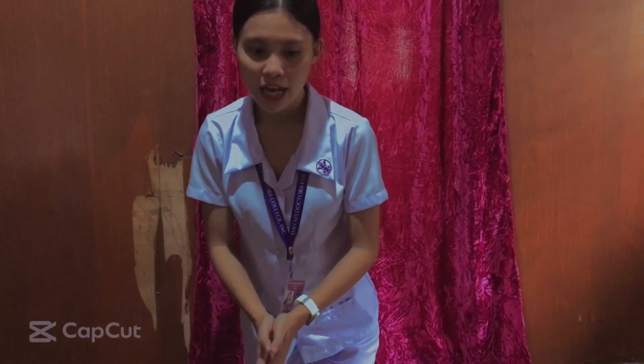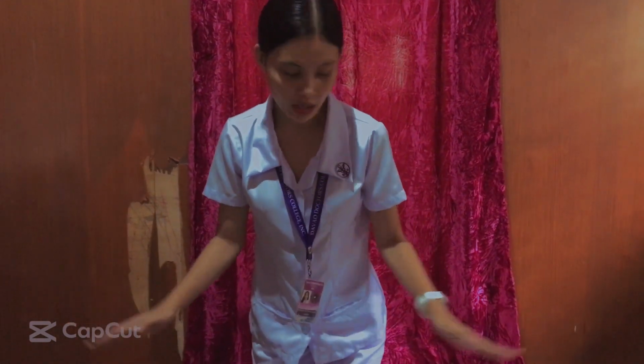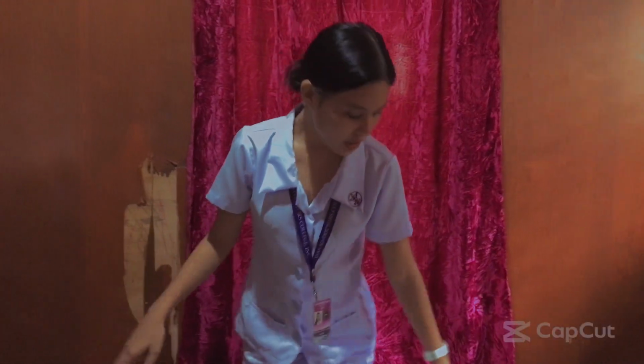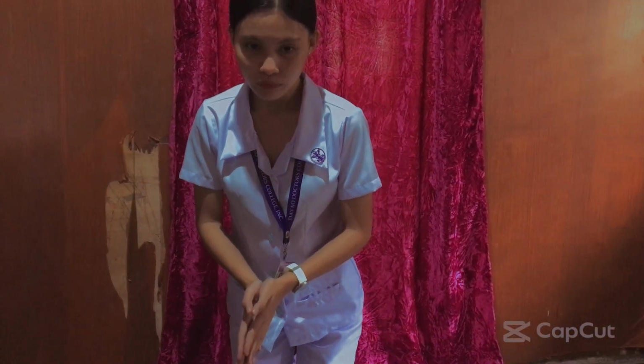Right now we're going to wait for the analysis, and we're going to clear to deliver the shock. Everybody clear, shock, deliver. Right now we're going to continue the compressions.